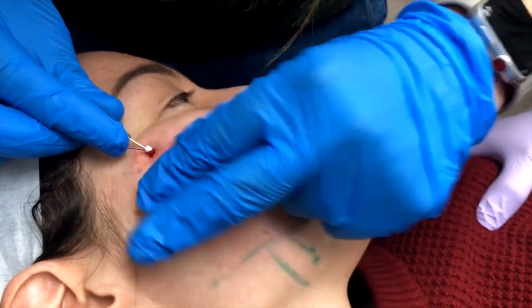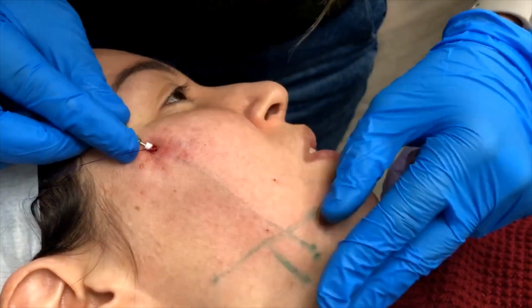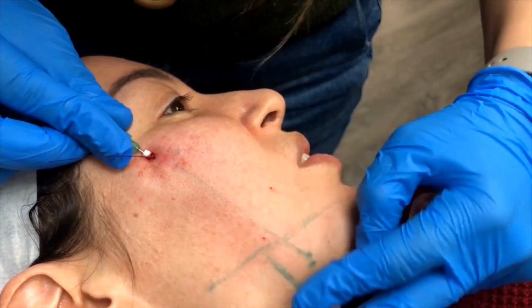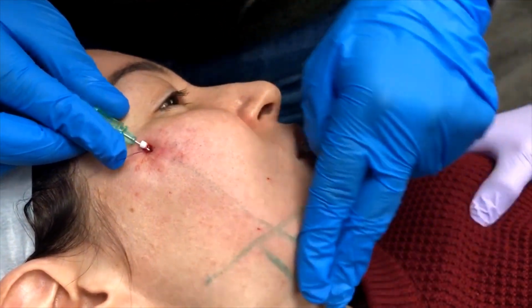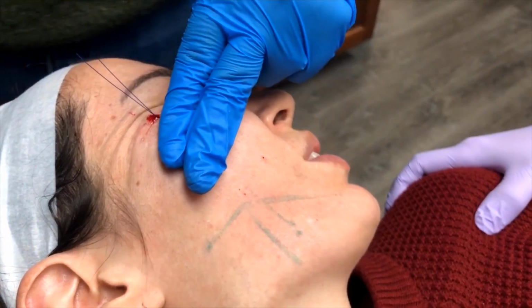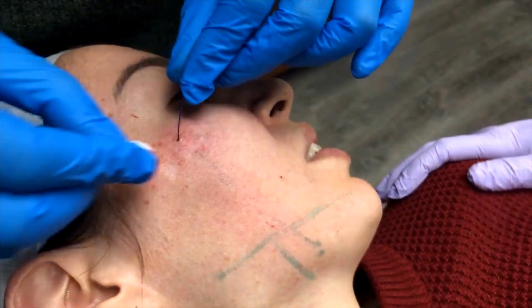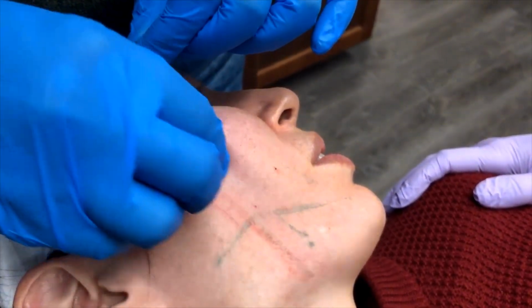And now once we get to place, we are going to really start to make sure that we are perfect. Exaggerate the tissue, pull it out, and you are going to hear a click, click, click. You're going to feel it with your hands as all of the PDO thread cogs and barbs go to place and really lift up that tissue.